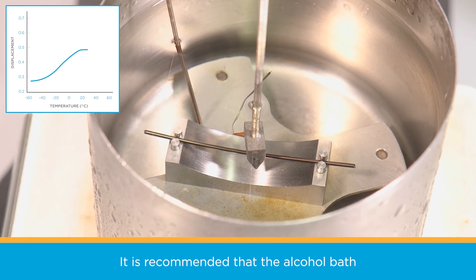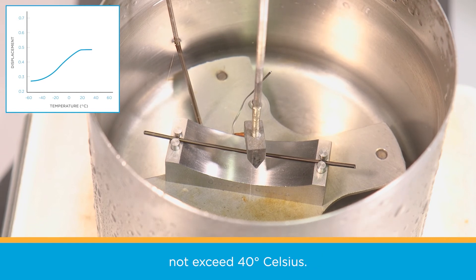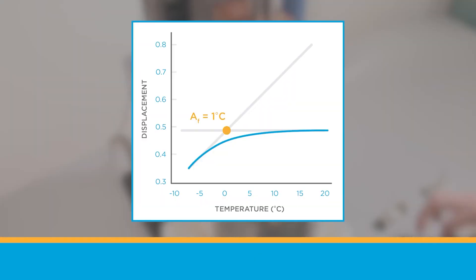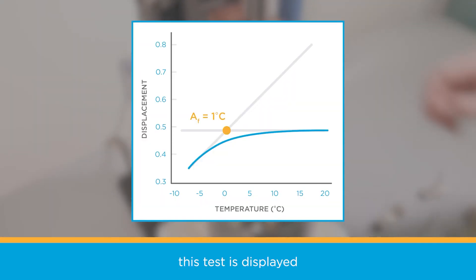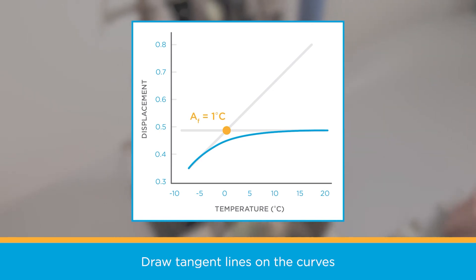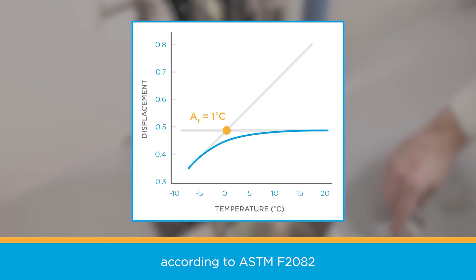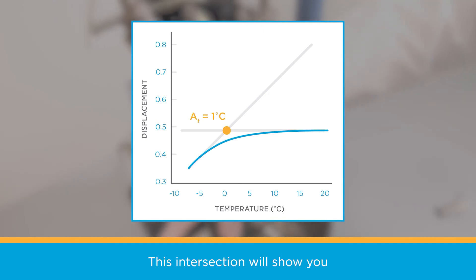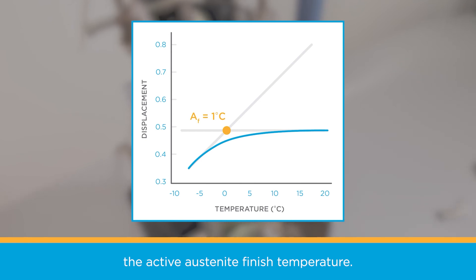It is recommended that the alcohol bath not exceed 40 degrees Celsius. Different media will need to be used for nitinol with warmer transformation temperatures. The data collected from this test is displayed by a displacement versus temperature plot. Draw tangent lines on the curves according to ASTM F2082 to find the intersection. This intersection will show you the active austenite finish temperature.